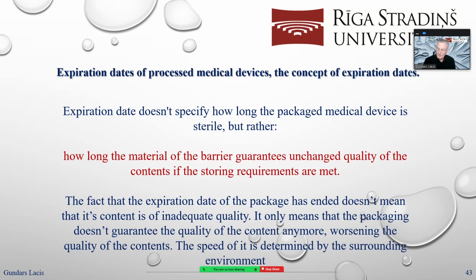After the expiration date is over, it doesn't mean that the instrument inside is non-sterile. It means only that the packaging system cannot guarantee, and the instrument surface starts to become non-sterile. How fast it is going on depends on the environment around.